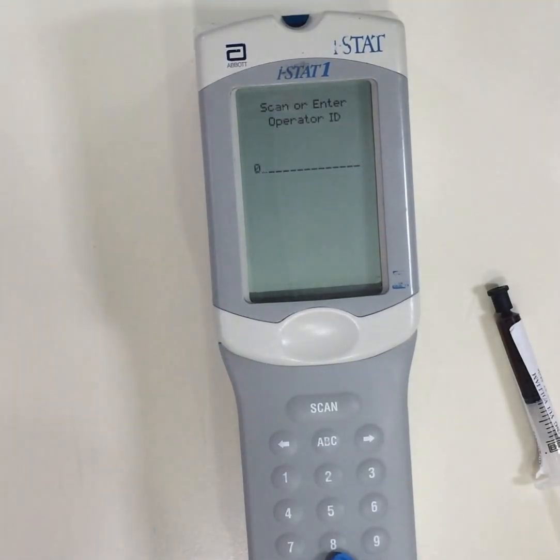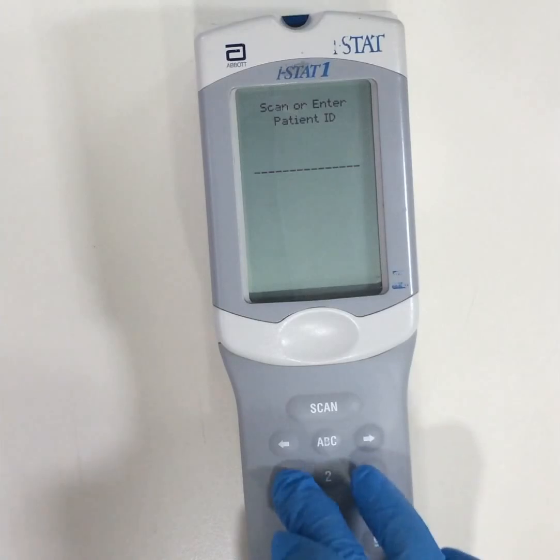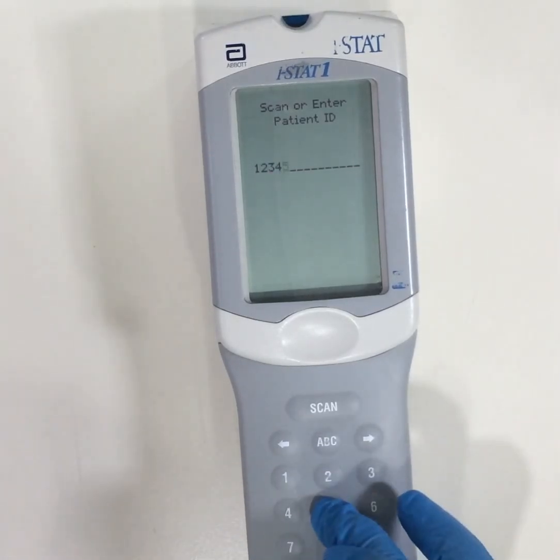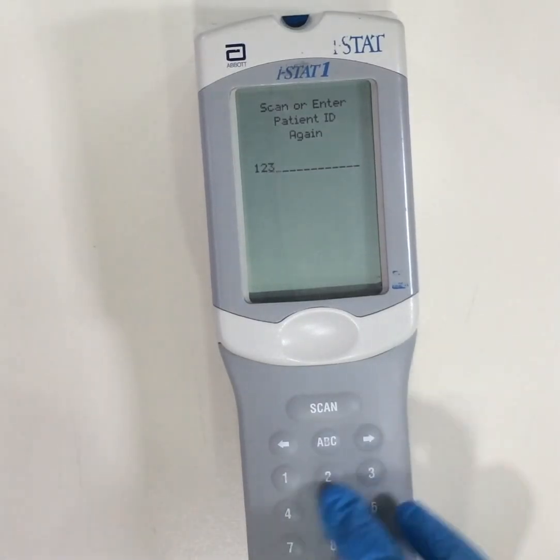You are able to scan or enter the operator ID. It might prompt you to do it again. After which, we scan or enter the patient ID. It might prompt you to repeat.